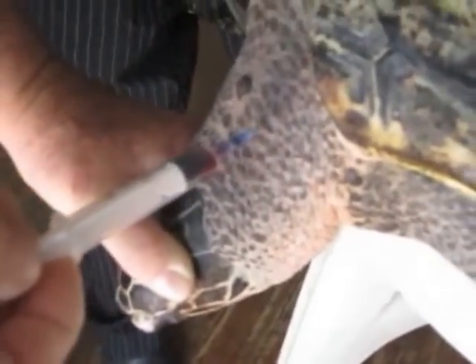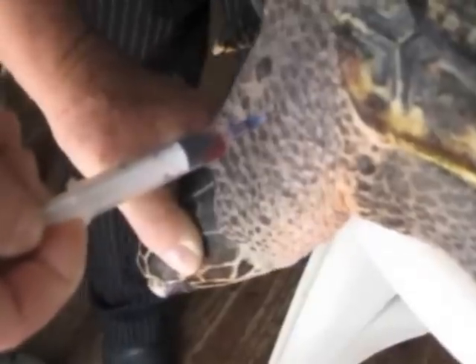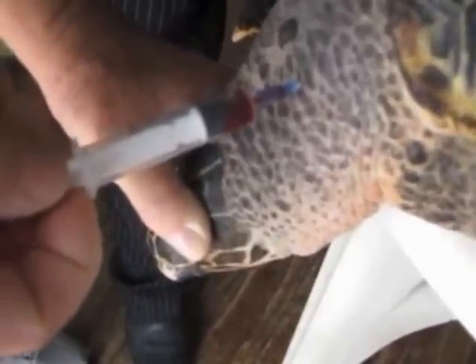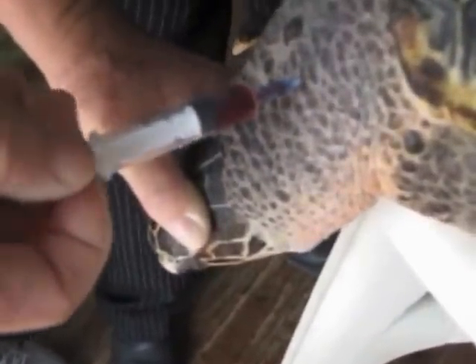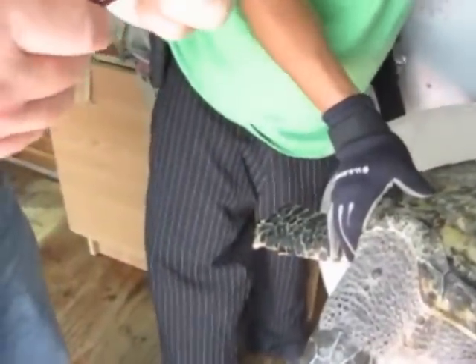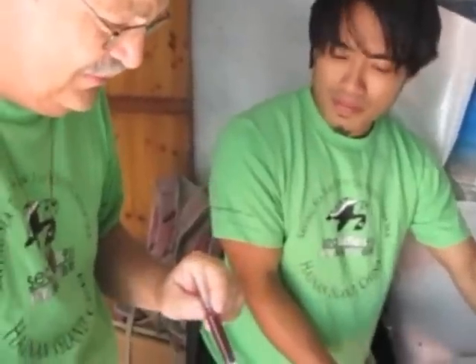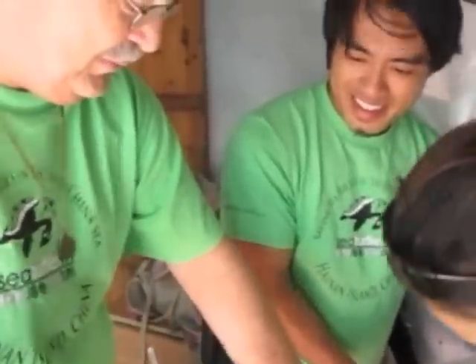You're going to find the spot again — there's the one, I think. There's the place. Kind of wait and drawing a little bit more while it comes out, pulling back. Okay, that's basically it. There'll be a little leakage after you do that. Doesn't always happen that easy, but I'm happy it did. So there's your good stuff. Sometimes there'll be some leakage coming down — don't worry about it, it's just capillary leakage.